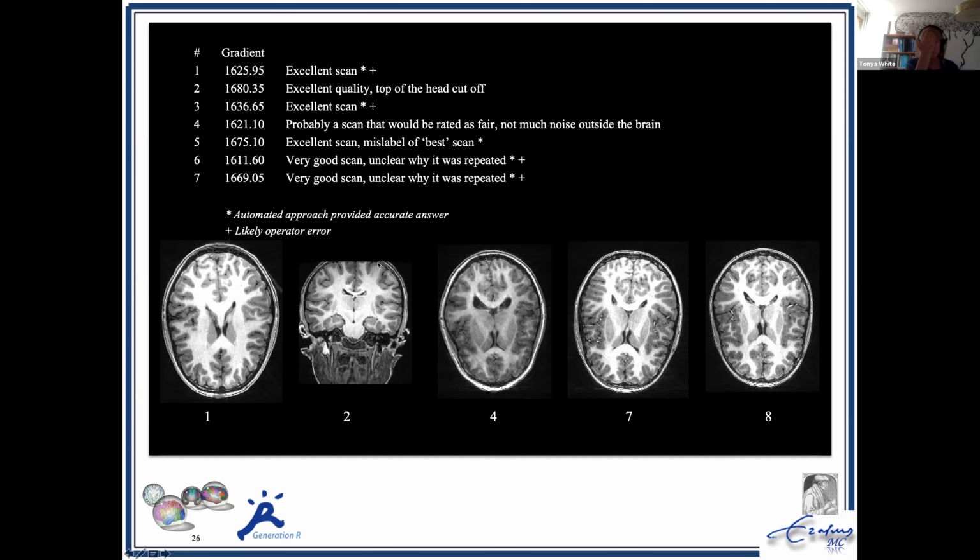And the algorithm as it was couldn't pick up that, but that wouldn't be too hard, because there needs to be air above the top of the skull. And if there's no air, you could flag it. So in essence, there were a number of scans where the AUC could actually be better. Then there was the question of what if you repeat the scan? Is it worthwhile to repeat the scan if you have a child with a bad scan?